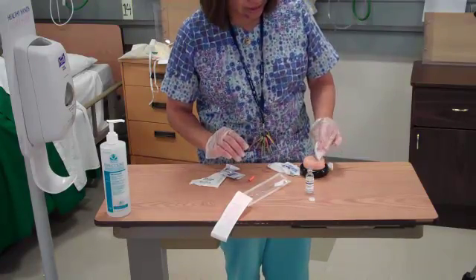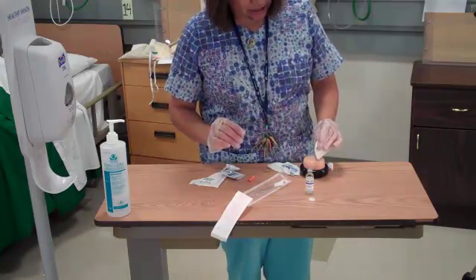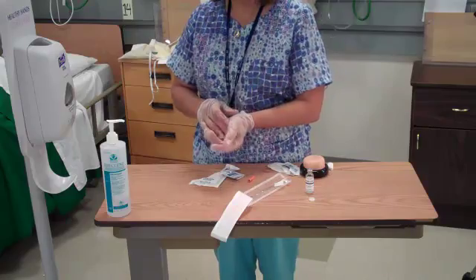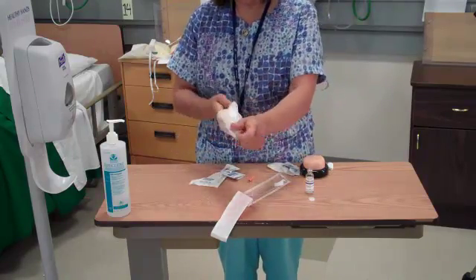Go ahead and assess the site, make sure that there's no bleeding or bruising, and the patient has tolerated the procedure well. Then you would go ahead and take your gloves off and document your medication.